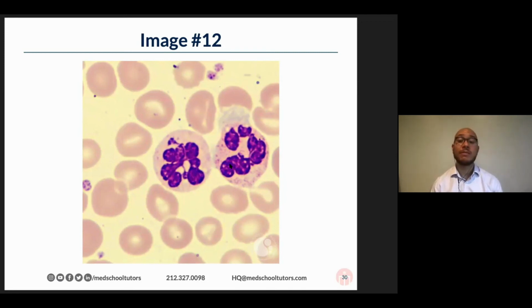And folks have already been pointing out B12 and folate as the two big culprits. Honestly, if you're going to be tested, that's probably what it's going to be. Keep in mind, though, that there's a few other things, which we'll cover in a moment, that can give you hypersegmented neutrophils and that abnormal morphology. Here's one that people sometimes get tripped up about.